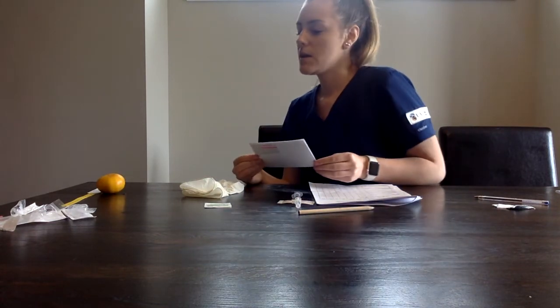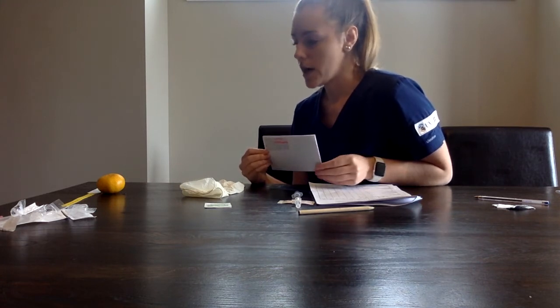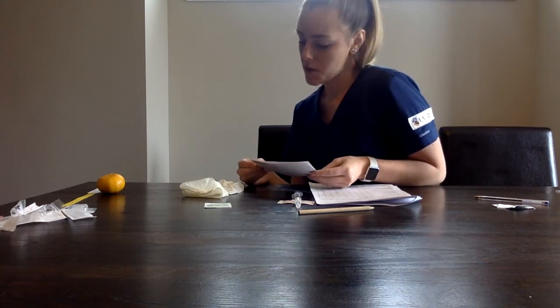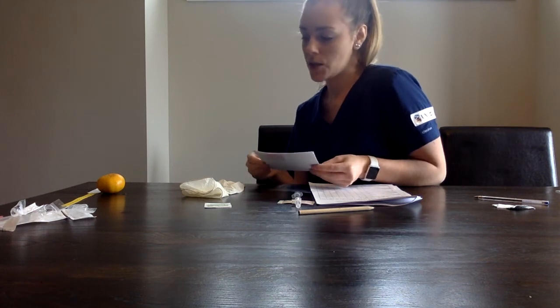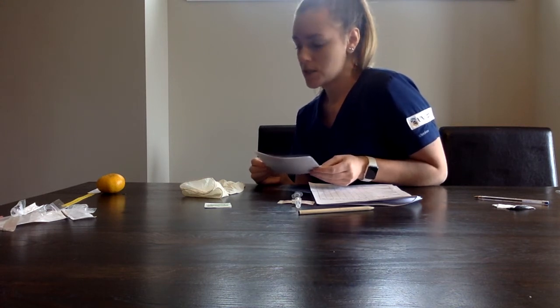So Jake, we're going to be giving you a drug called hydromorphone. It's an injection that is going to go into your abdomen. This is for the relief of moderate to severe pain that you had said you were experiencing. Some side effects may be confusion, dizziness, headache, so just be careful when you're switching positions.